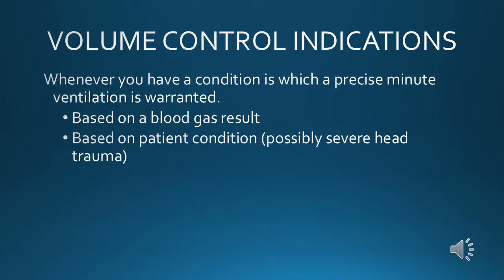Okay. I know the big thing is the ARDSNet protocol. The ARDSNet protocol is all based on volume control. ARDSNet is something that will be addressed in some later videos. That again could take several hours to cover, something we can't cover in basic modes of ventilation.